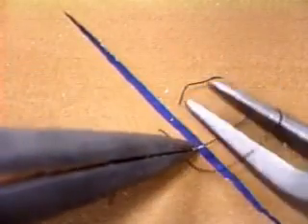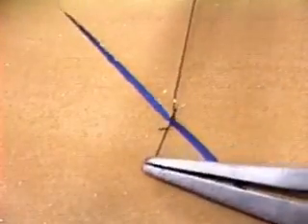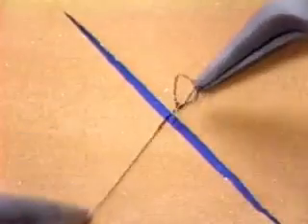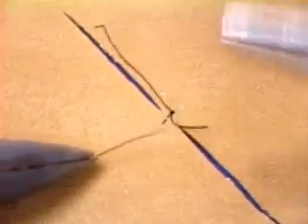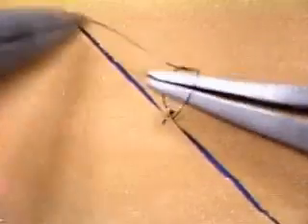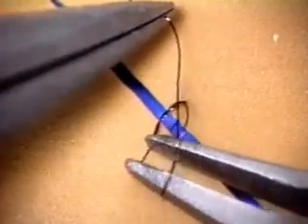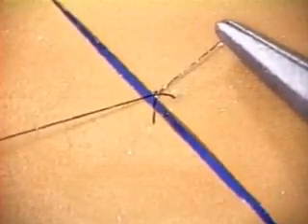Now let's look at how to tie a knot. Tying a knot looks so simple — so why is it that when you first try it, things go so badly wrong? You'll be glad to know that those scenes are not a necessary part of the human condition. There are some simple tricks that'll make knot tying easy for you.